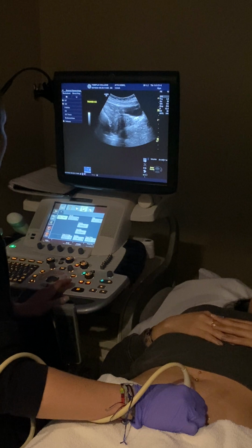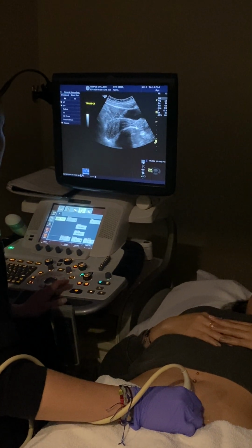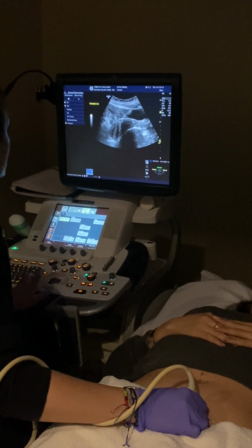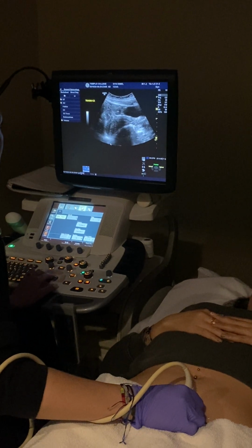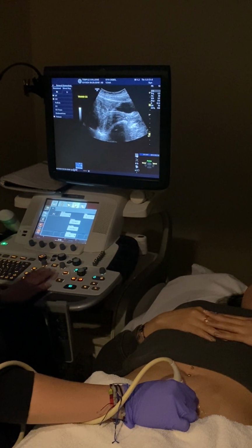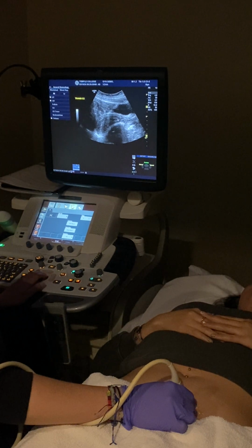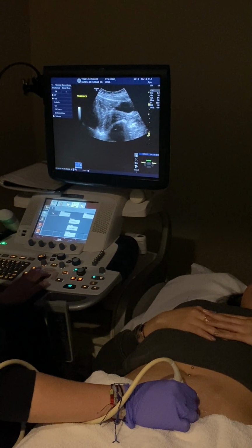So to lengthen it out, you have to go to that organ. And her bowel is moving up here, creating those shadows. Okay? So right about here is going to be my midline uterus. So this is vaginal canal, long cervix, that central hyperechoic, and then leaning down into the endometrium, and this is the fundus of the uterus.